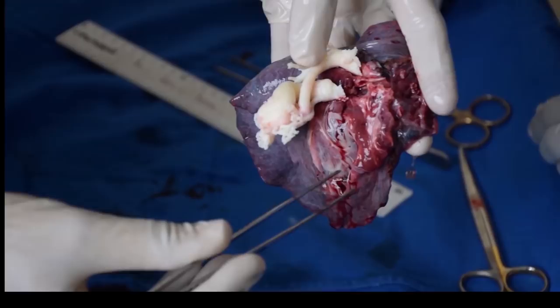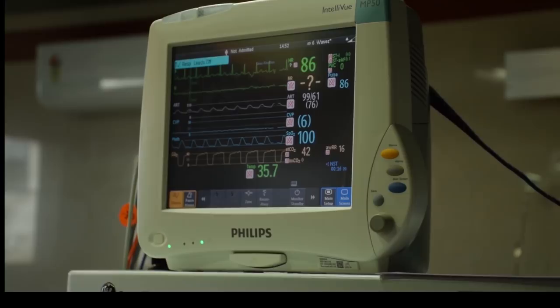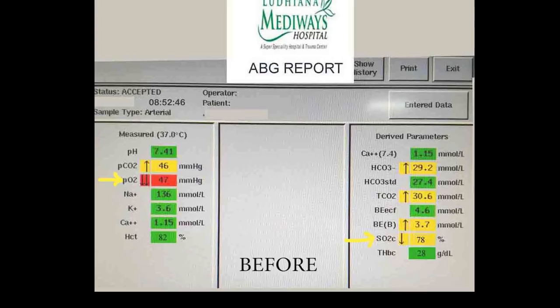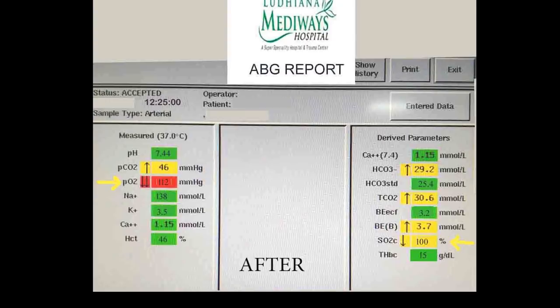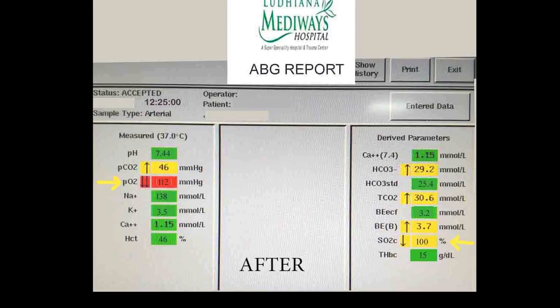The moment we clamped the pulmonary artery, saturation came up to 100%, as you can see. The patient tolerated the procedure well. These are the arterial blood gas comparisons before and after. The patient is nice and pink post-operatively — a happy young man now, doing very well.